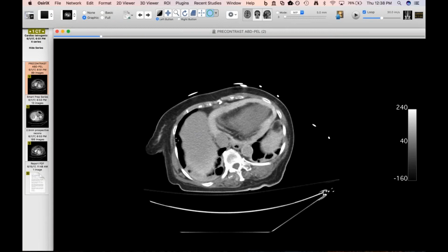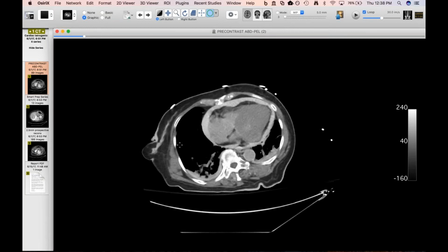Wow. Why is there angiography as part of the TAVR? What exactly are they doing with contrast during the procedure? They're just looking at the aortic anatomy, at where the coronaries are. When they're trying to place the valve, they use a lot of contrast, repeated injections, just to make sure they have the valve seated in the correct place before they inflate it.